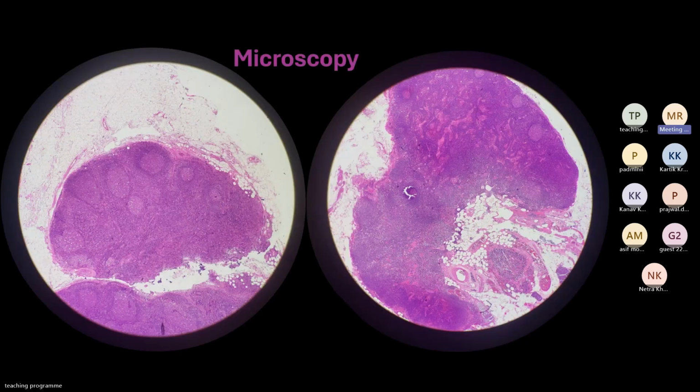Coming to brief microscopy pictures. This is how a reactive lymph node looks. We can see the germinal centers and the lymphoid follicles at the periphery. And this is near the hilum. Over here, another picture of reactive lymph nodes. Here we can see the dilated sinuses. So these pale areas are in fact the sinuses.